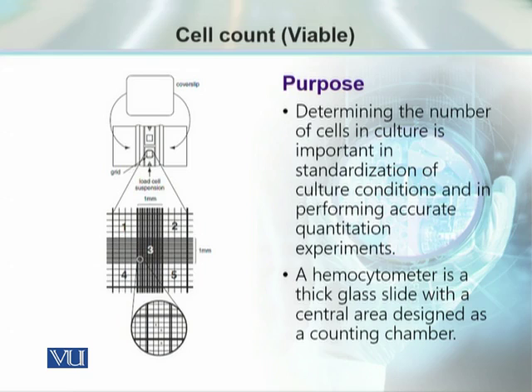अब हमारे पास जो cells हैं for counting, we determine the cell count using either of the areas, whether that particular area designated for red blood cells or that designated for white blood cells. इस पिक्चर में अगर देखें आपको 1, 2, 3, 4 और 5 के हवाले से कुछ एरियाज विजिबल हैं.